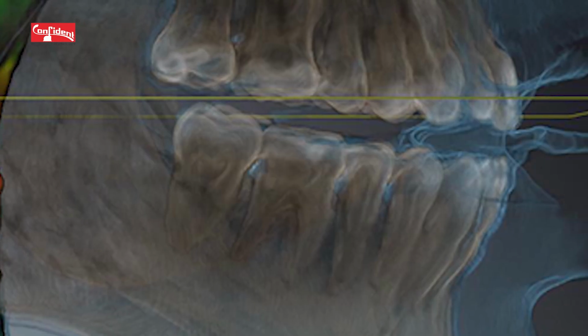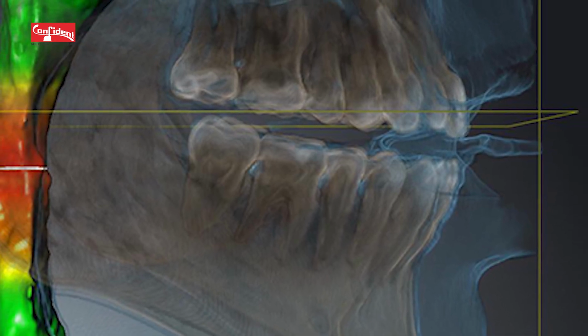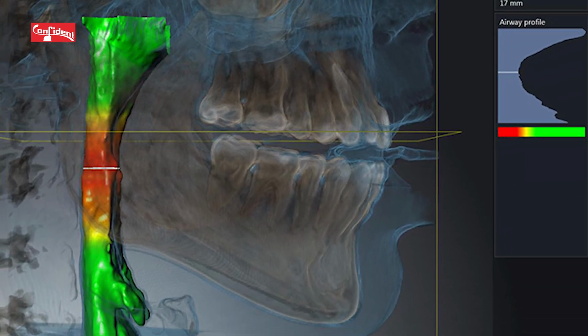Yes, sir. I actually missed that point in the previous question. Sleep apnea is catching up now. It is called a silent killer as well. CBCT plays a major role in assessment, both pre-therapy and post-therapy. Post-therapy, we can see that the upper airway space increases. Not only that, in relation to ENT also, middle ear infection, or the assessment of any components associated with the ear, can be identified with CBCT.